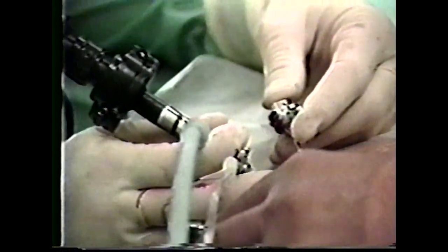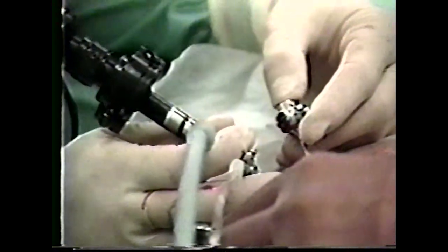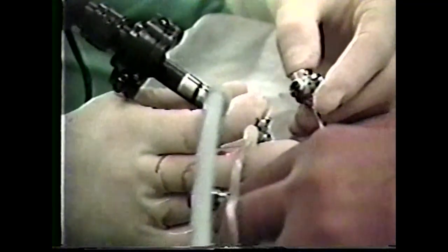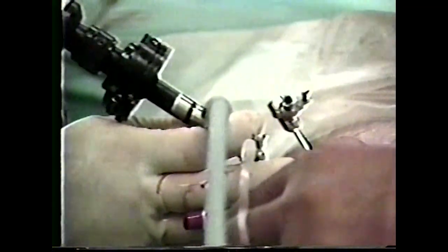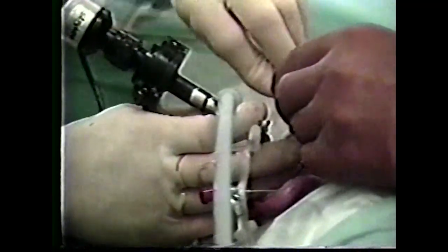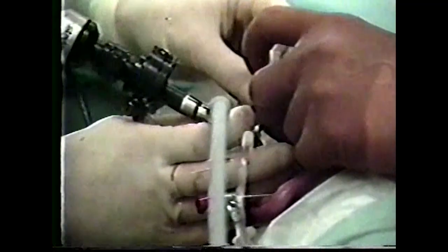As with the placement of the other cannulas, proper entry into the joint space is again confirmed by the irrigation backflow when the trocar is removed. The anterior lateral portal may be used for arthroscopic visualization or the introduction of instruments. Sealing the anterior lateral cannula with a rubber cap allows for control of fluid backflow during instrumentation.